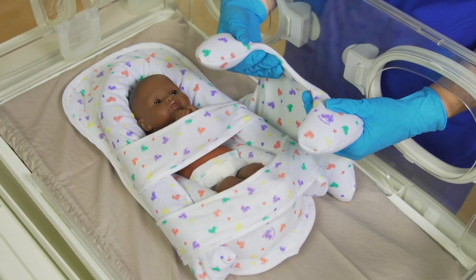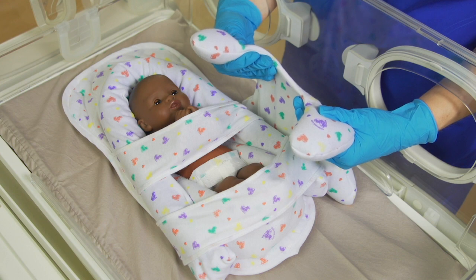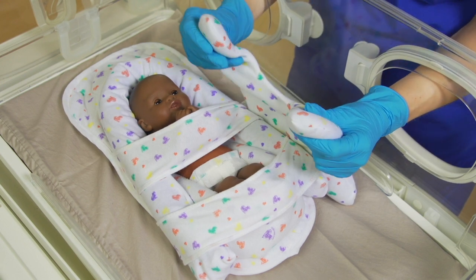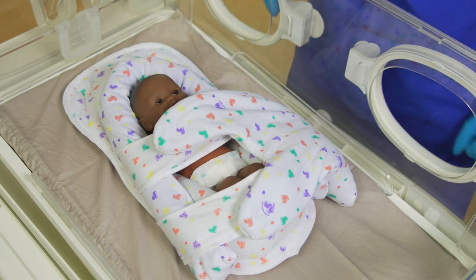Frederick T. Frog can augment the bendy bumper for support. Moving the adjustable beads creates the appropriate boundary height. It's important to remember that Frederick T. Frog is designed for weighted support, so do not place its full weight on the infant.